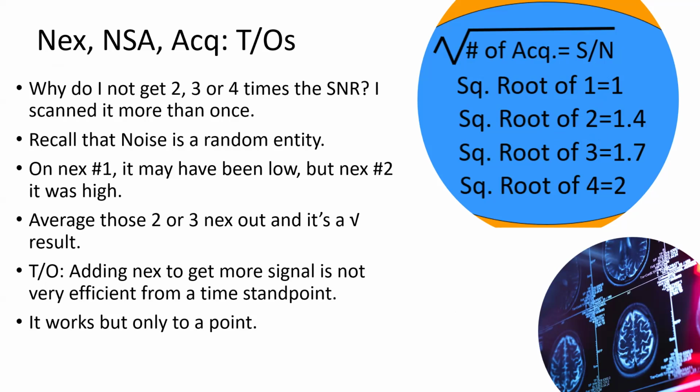And they like to say, if you need to double your signal to noise and you're using 1 NEX, how many NEX do you have to do?